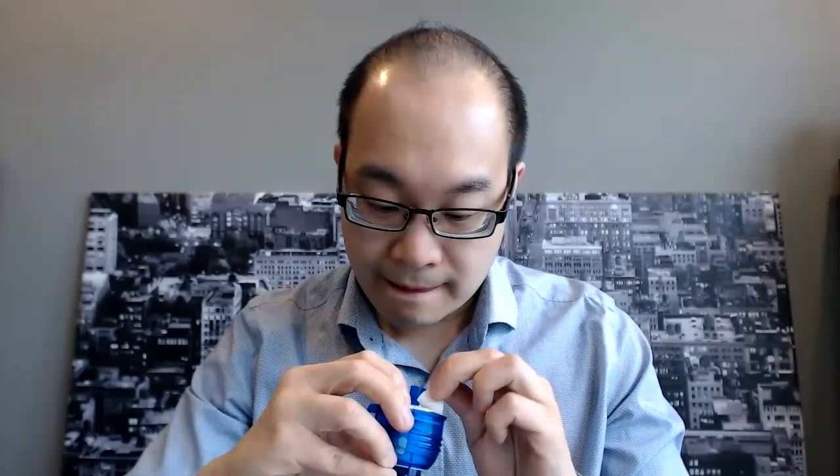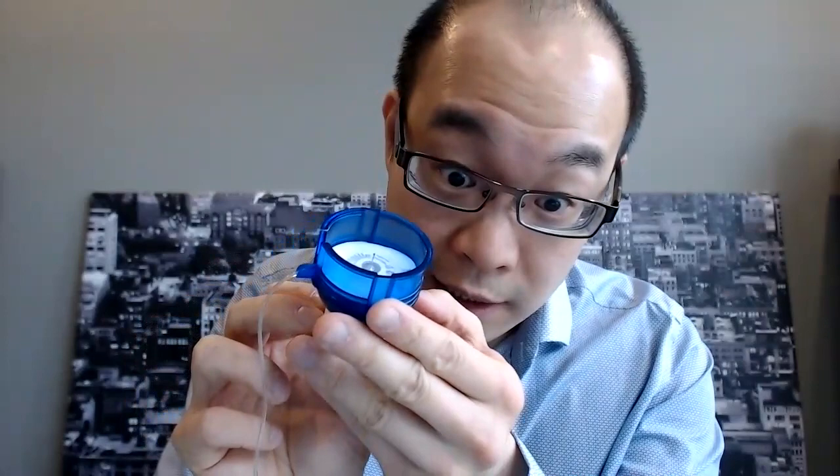Okay, so typically this stuff is really sticky. You make bunny ears, like so. You can push it in and remove the adhesive. Okay. And then most importantly, I need to get rid of this thing that protects the needle. And there you go. That's what it looks like inside. There's the needle, and I'm going to insert this right now.